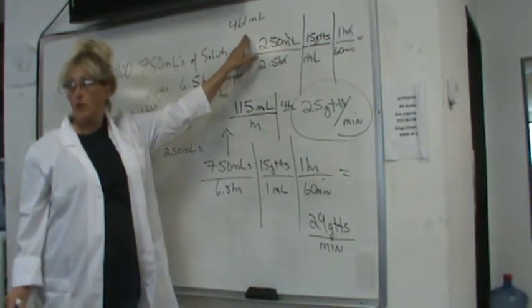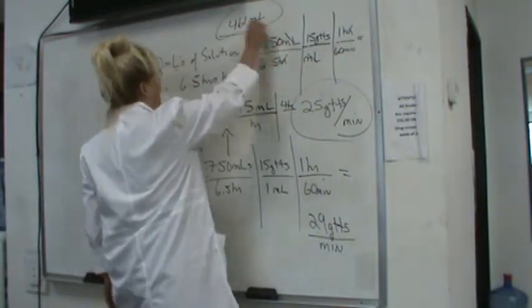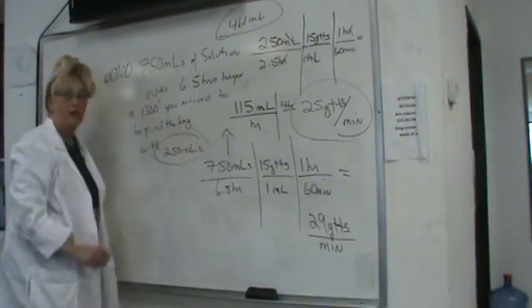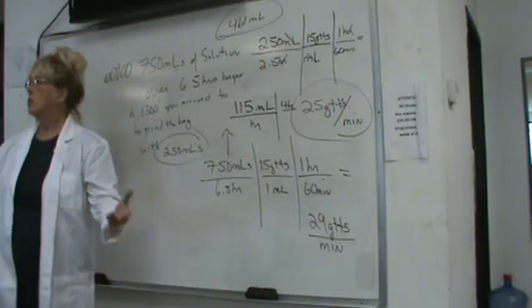So what's left in the bag? In 4 hours, technically, this is how many mLs should have infused. But how many mLs were left in the bag? It was going too fast.